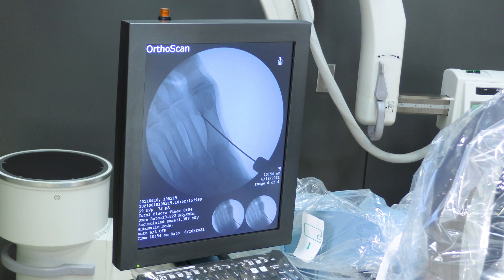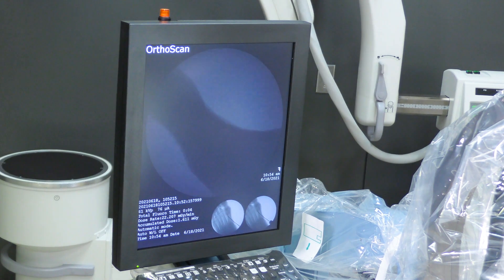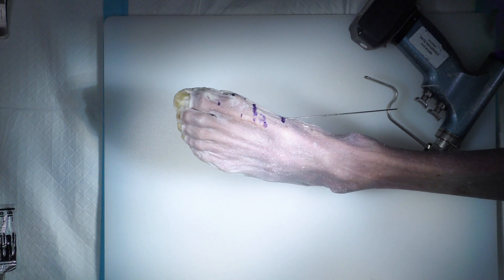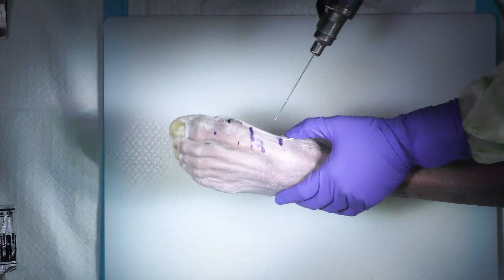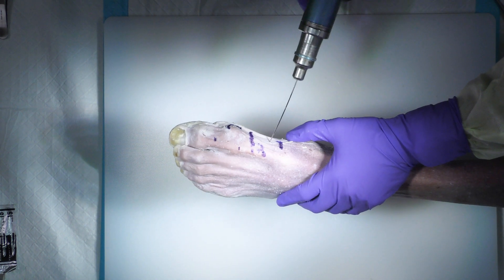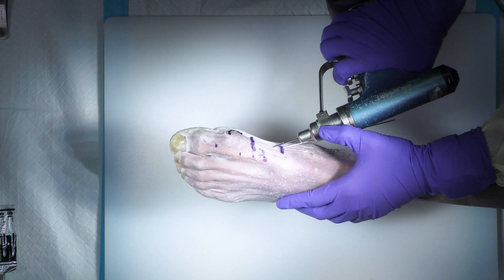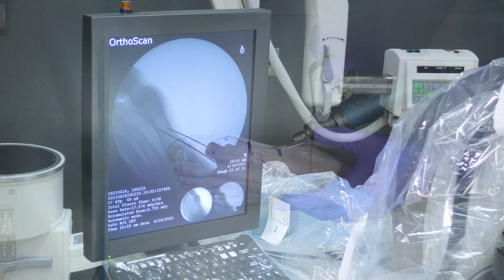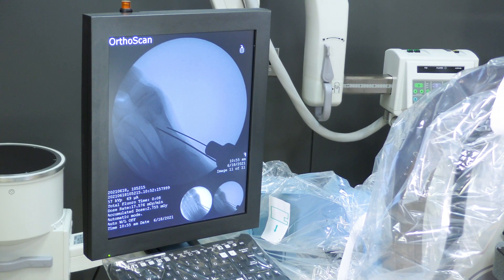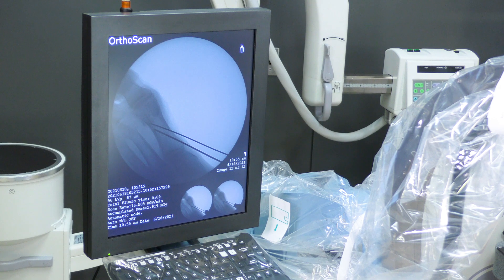I check on the lateral view — that looks good — making sure I'm going to stay in the metatarsal. Then for my distal screw, I make sure it's a bit more plantar to capture what I want. Same concept: go into the metatarsal, go through that first cortex, drop my hand back, following the same trajectory but intentionally being a little more plantar on this one. I like both of those placements and I'll punch the cortex.